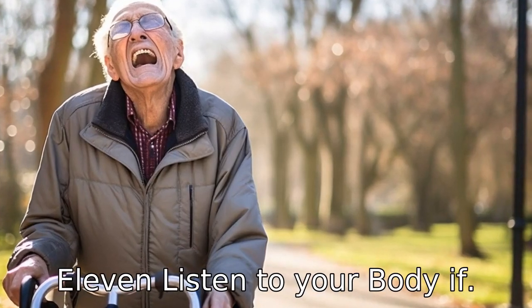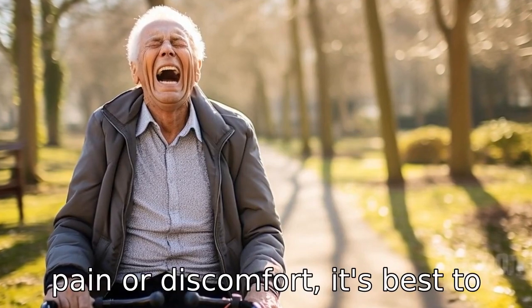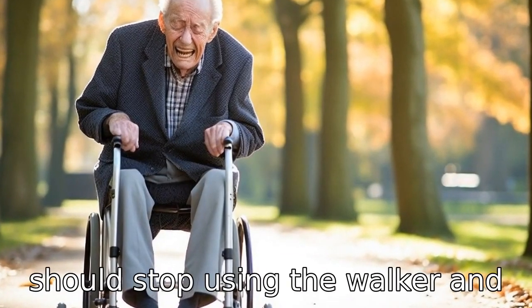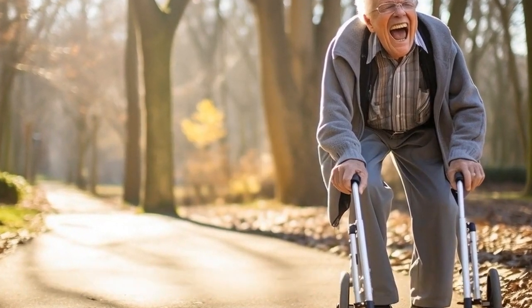Tip 11: Listen to your body. If using the upright walker causes pain or discomfort, it's best to not push through it. The senior should stop using the walker and consult with a healthcare professional if they experience ongoing discomfort.